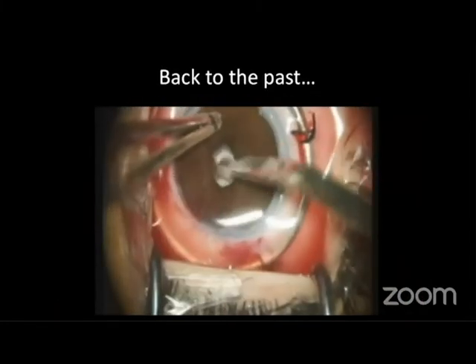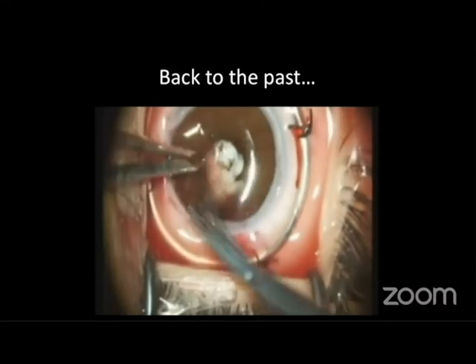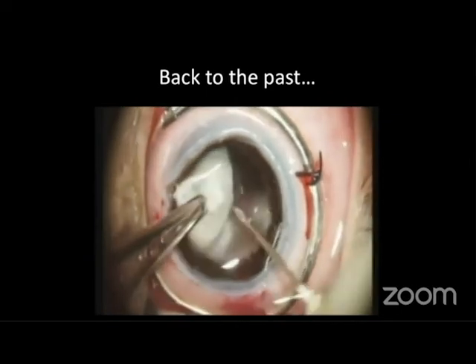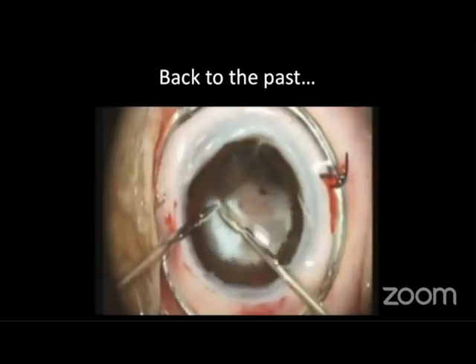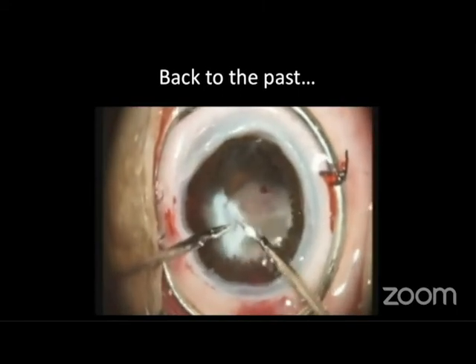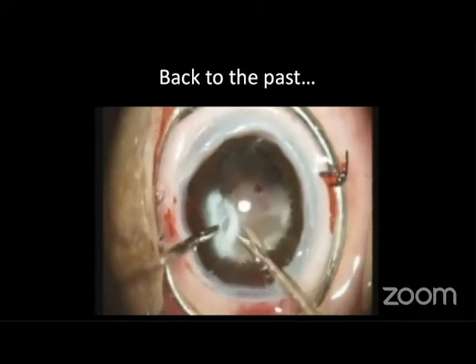And very, very rarely we do an open sky vitrectomy in ROP, and this is one such case where the iris was removed and the cataractous lens was removed. We were forced to do an open sky ROP surgery here because the cornea was opaque in this child, and this was the only existing eye of the child. The other eye had become phthisical as well.